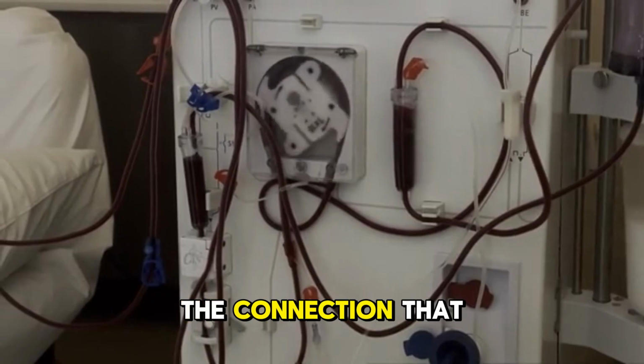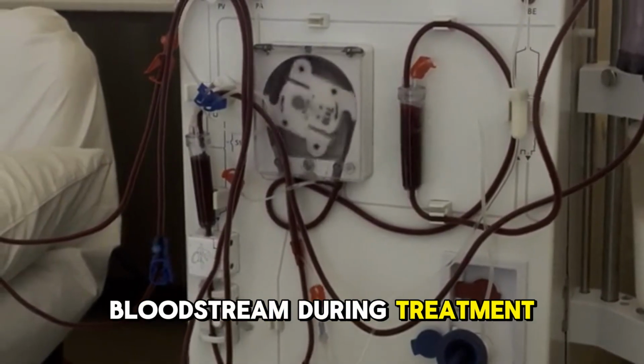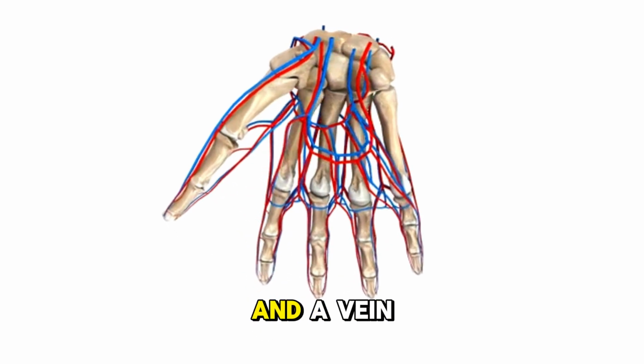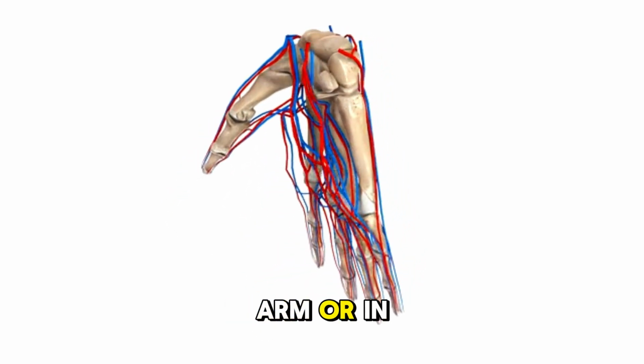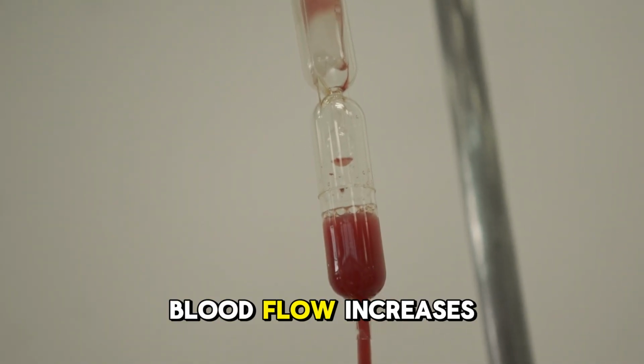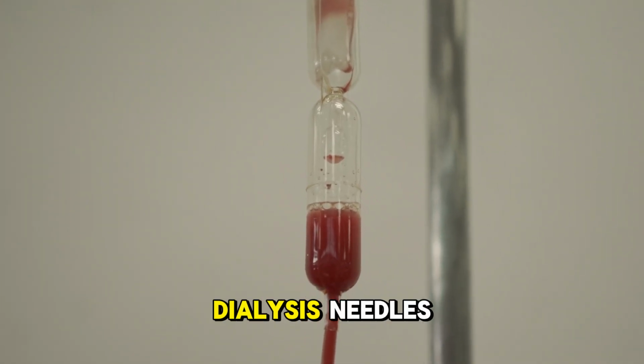Vascular access is the connection that allows the dialysis machine to access your bloodstream during treatment. The vascular access is usually created by joining an artery and a vein either in your arm or in your leg. By joining an artery and a vein, blood flow increases, making the vein stronger and suitable for dialysis needles.